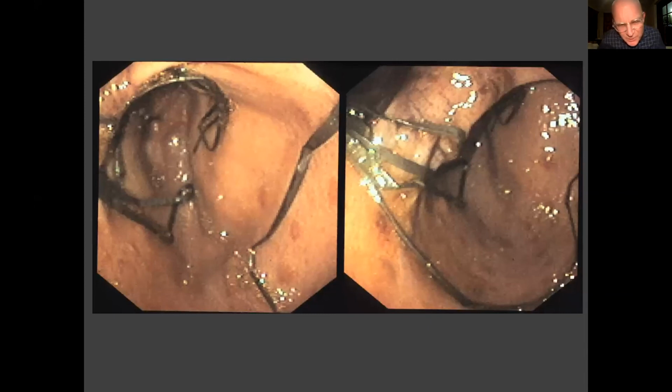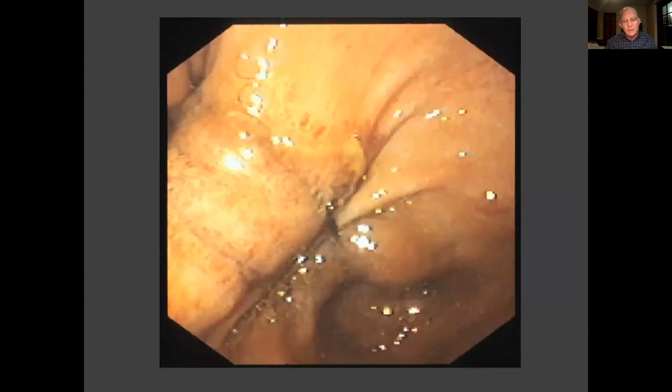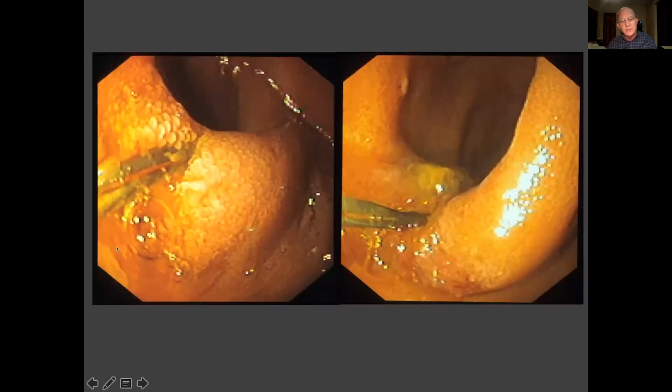Well, some of you are probably too young to remember cassette tapes, but this was a dog that ate, amongst other things, a cassette tape. So this is the tape unraveled in the stomach. And so as I looked around here, this is actually right here, that tape is actually gouging into the gastric mucosa at the angularis incisura, and then was going down into and through the pylorus. I was able to go ahead and pass the scope into the duodenum. And in the duodenum here, you can see that tape is cutting through the intestinal wall.